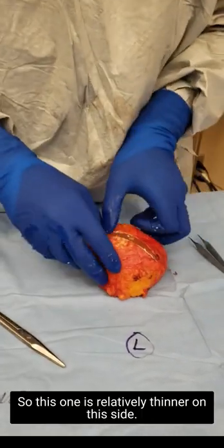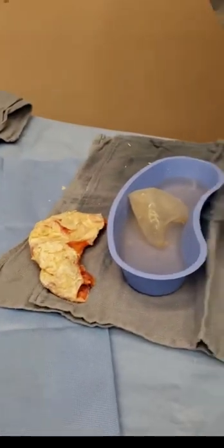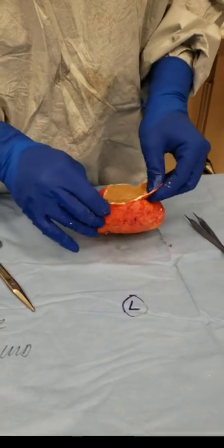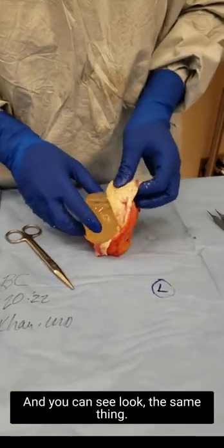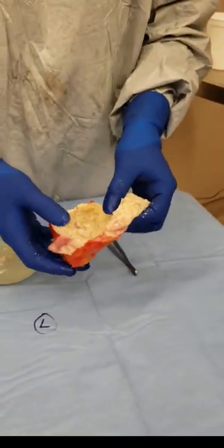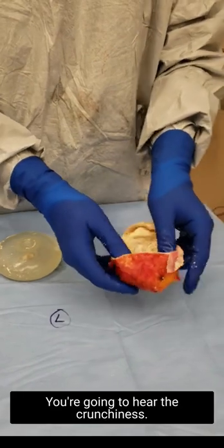This one is relatively thinner on this side — not as many scales. Look right here at this scale; it's very razor sharp. As I cut this, this implant is intact, and that one was intact. You can see it's like a shell — look at the inside; it can actually hold a lot of saline or any fluid, and everything contained. You're going to hear the crunchiness.